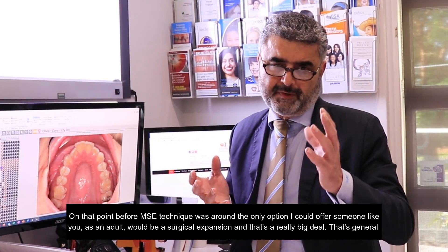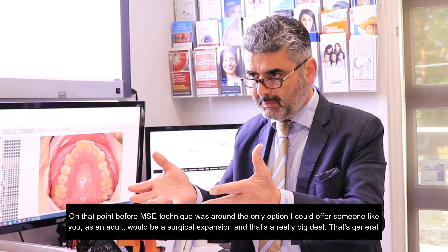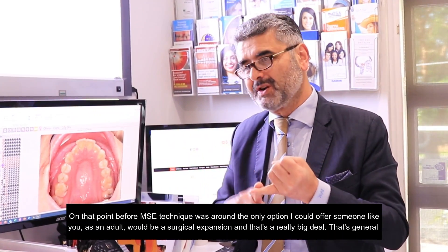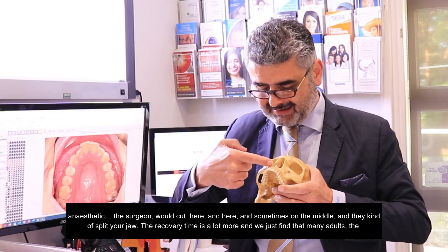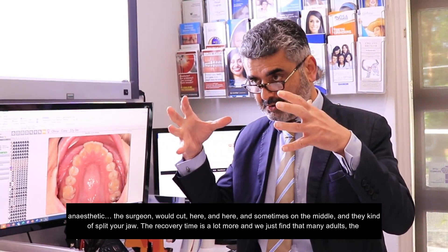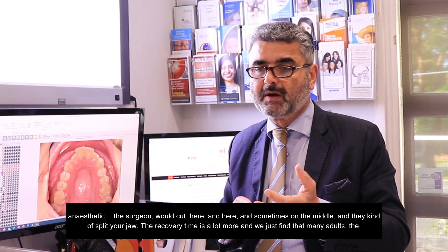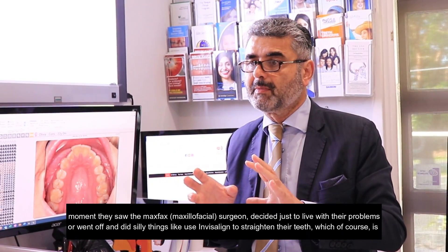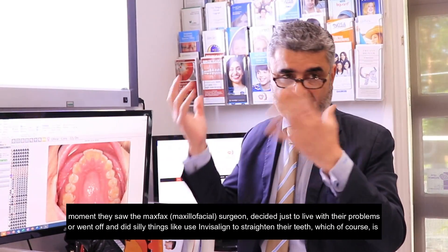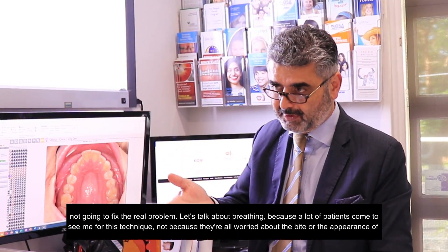Before the MSE technique was around, the only option I could offer someone like you as an adult would be a surgical expansion of the jaw — and that's a really big deal. That's general anaesthetic, and the surgeon would cut here and here and sometimes in the middle, and then kind of split your jaw. The recovery time is a lot more, and many adults, the moment they saw the max-fax surgeon, decided just to live with their problems or went off and did things like used Invisalign to straighten their teeth, which of course is not going to fix the real problem.